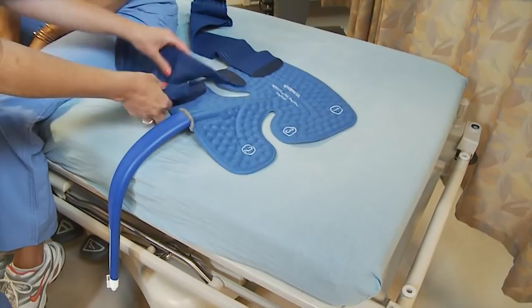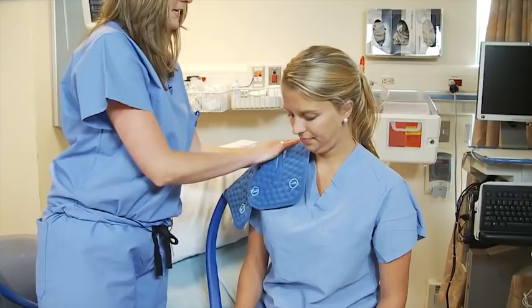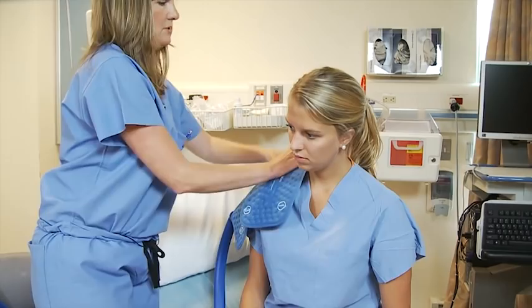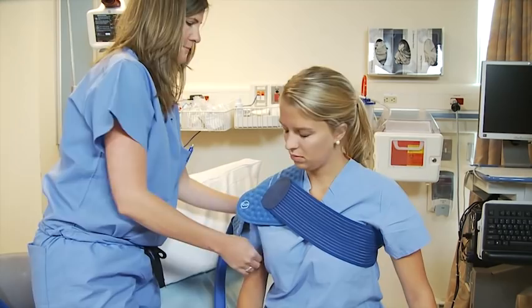Now we're ready to apply the pad to your affected area. This is where your shoulder incision is going to be and you want this to be up on your shoulder. It doesn't have to be tight — it's just meant to keep it in place. Strap number one is going to go up and under your arm. Number two is going to go under your arm, do deltoid. And the third one is going to go up and under your armpit.